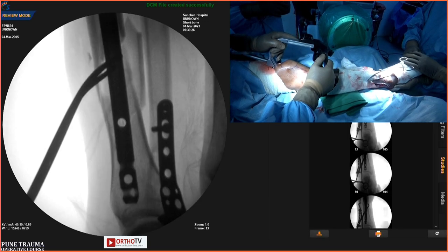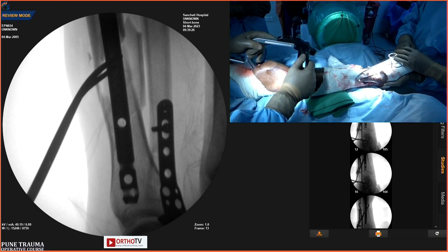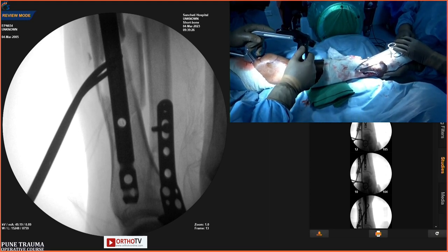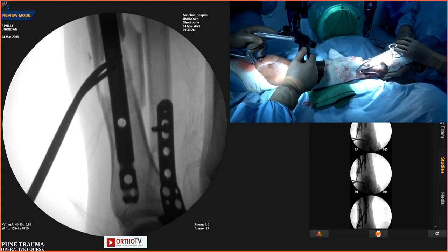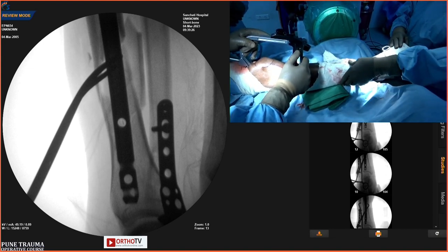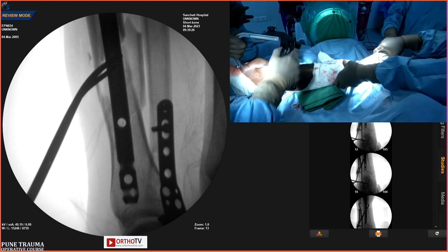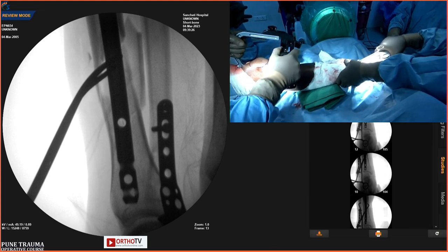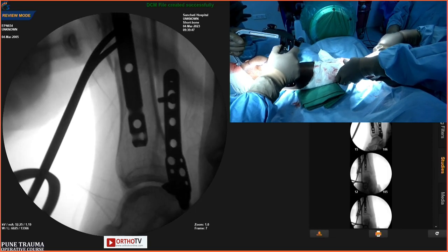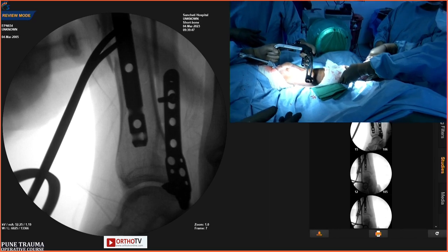Dr. Gadegone, sir. Yes, sir. You improved the reduction further when removing the guide wire and passing the nail. No, that was manual. Yes, sir, manual, because I am holding the fracture. Still, now we can also improve the position again. Bring it a little out. Do you have any anterior angulation, about 5 degrees? Maybe. Yes, that I am correcting now. Now hammer. Sir, is it okay? Yes, sir, it looks good.